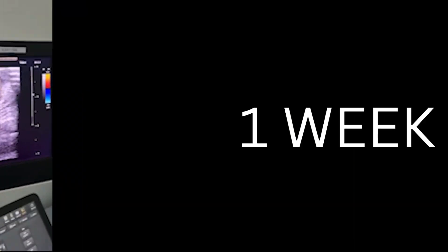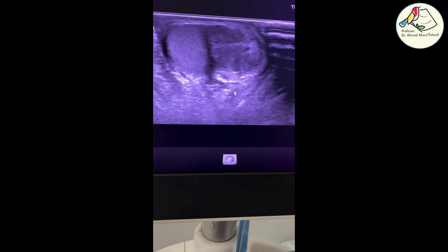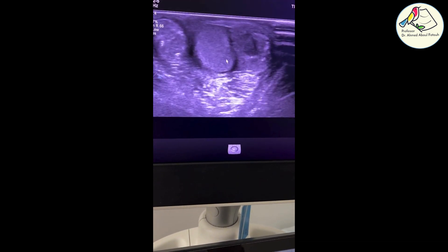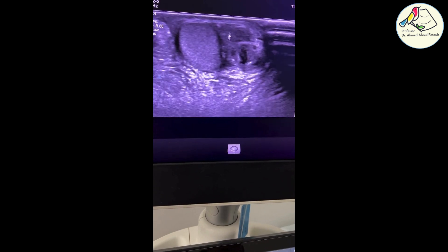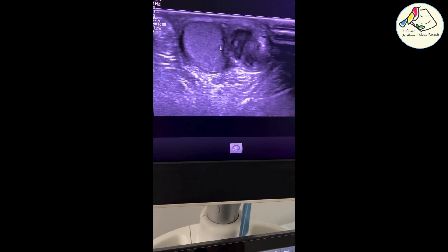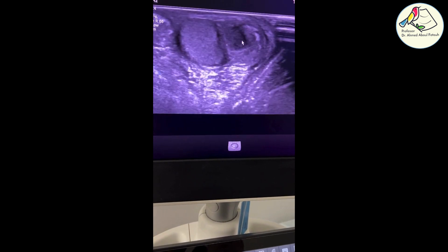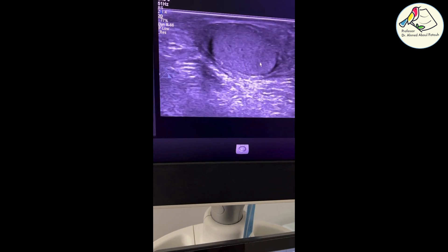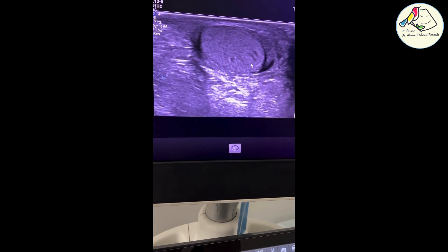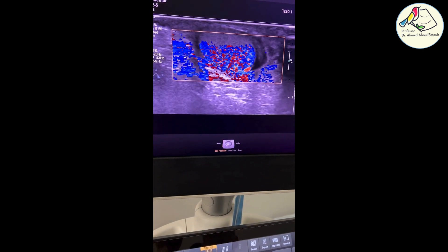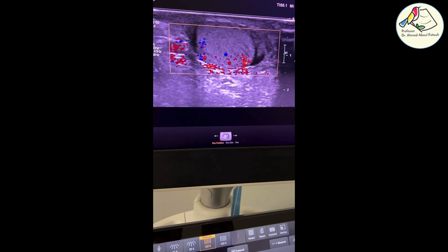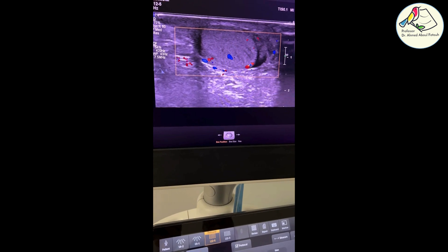After one week of follow-up of the same case of left testicular trauma, we conclude that this tissue is outside the testicular tissue — meaning it is an organizing hematoma beside the testicle, not inside it. The Doppler study shows the testicle is well and its vascularity is intact. No torsion, no testicular rupture. Thank you.